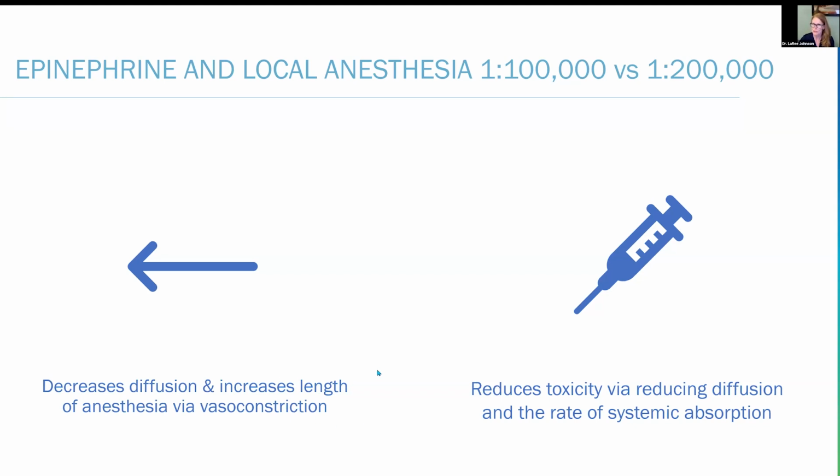So epinephrine's use, it's still a good thing. For me, now in my journey, what epinephrine tells me with the blanching is I have this beautiful diffusion, so I feel good about it. It's my confidence marker, but it really no longer plays a role in the safety, because this is the safest way to deliver local anesthesia for children.